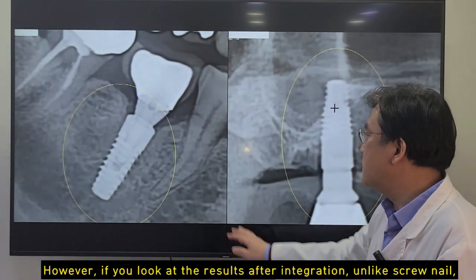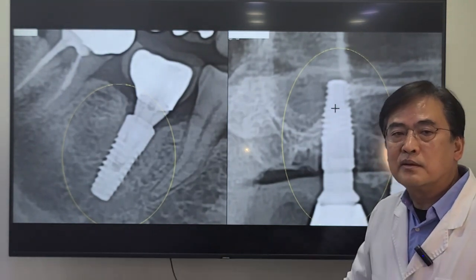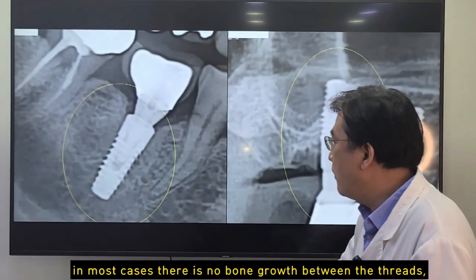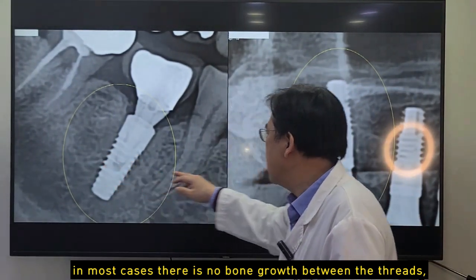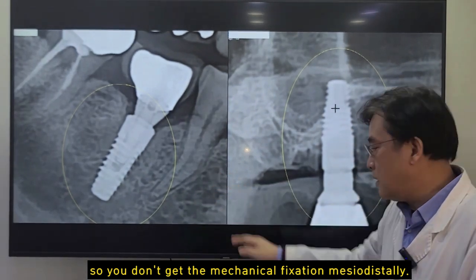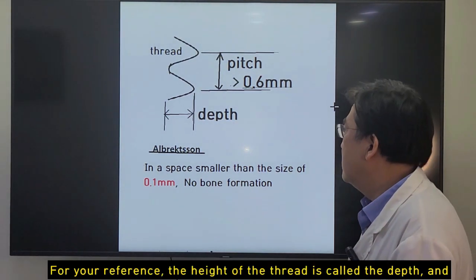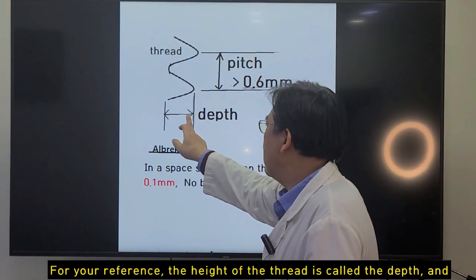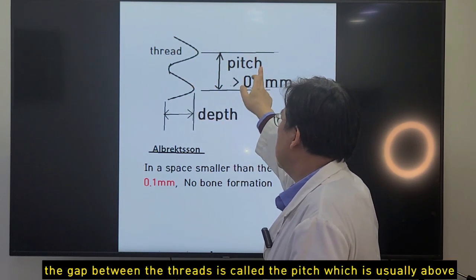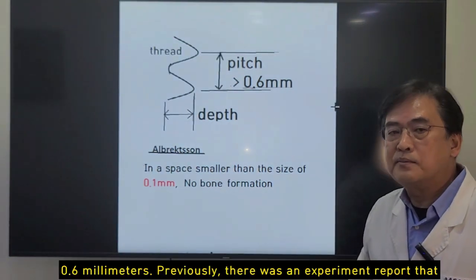However, if you look at the result after integration, unlike a screw nail, in most cases there is no bone growth between the threads, so you don't get the mechanical fixation mesiodistally. For your reference, the height of a thread is called depth, and the gap between the threads is called the pitch, which is usually above 0.6 millimeters.